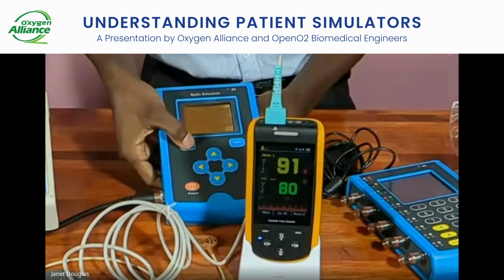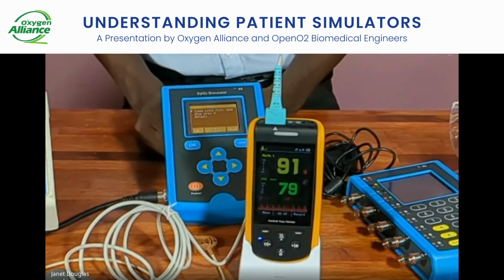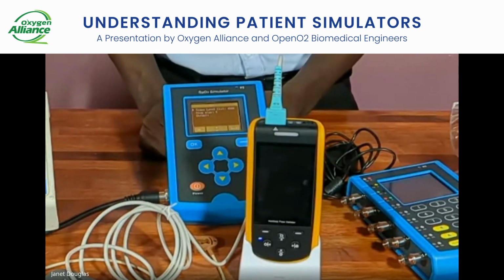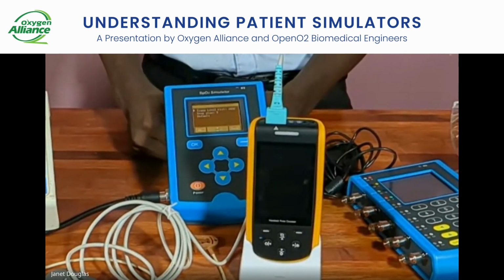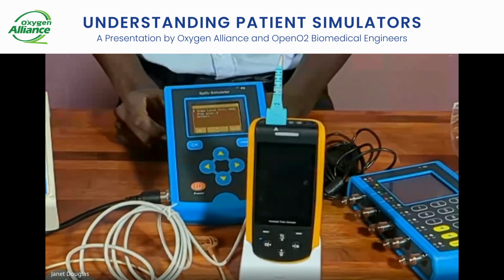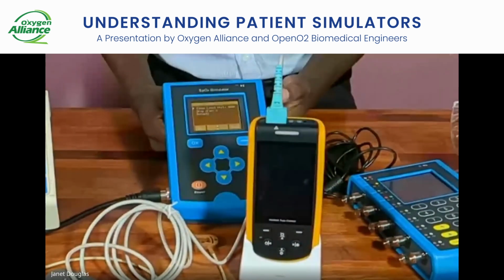Then you also have TLC, which stands for translevel control, because using the patient monitors, you're going to use it on different patients with maybe various skin shades, maybe different sizes when it comes to the finger. So the translevel control just tries to simulate different conditions. If let's say the patient has a large finger that is fitting perfectly on the probe and also has a small finger that is not making proper contact with the sensors, ideally, you still want to get the same value. So this just tries to mimic various conditions when it comes to the patient.